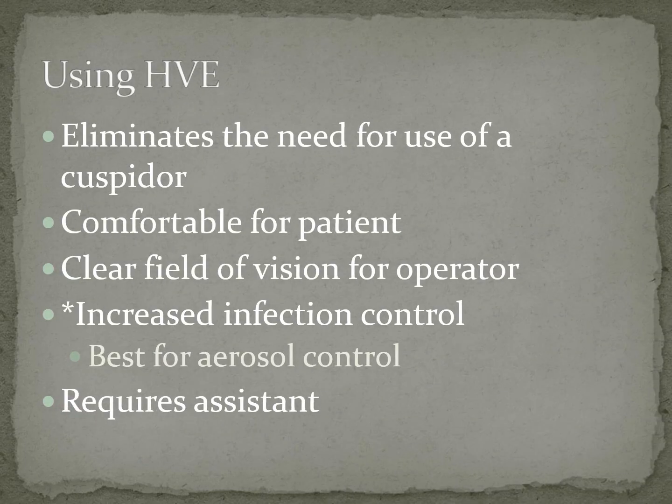Okay. The HVE is going to eliminate the need for the use of a cuspidor. I don't even know if you guys know what cuspidors are, but they used to be on all dental chairs, and it was just a ceramic bowl that your patients would sit up and spit in. So we didn't use the saliva ejector a lot. We would let the patients just spit in this bowl. And they've kind of gone by the wayside because they're dirty. No one wants to clean them, but that's what a cuspidor is.